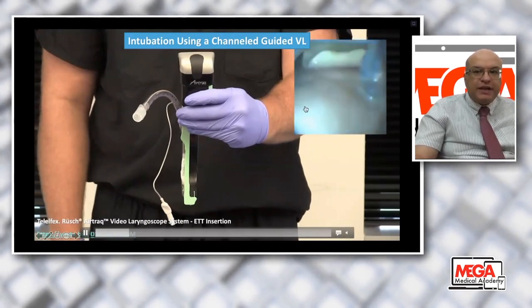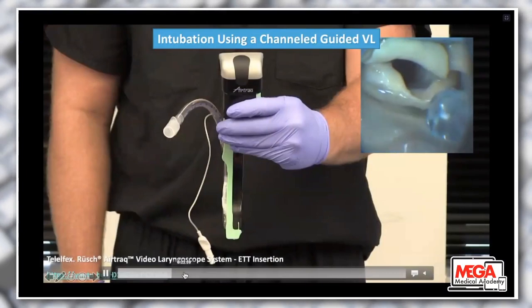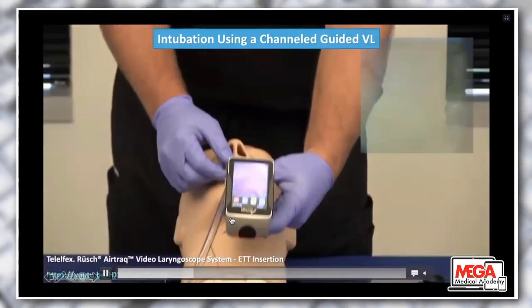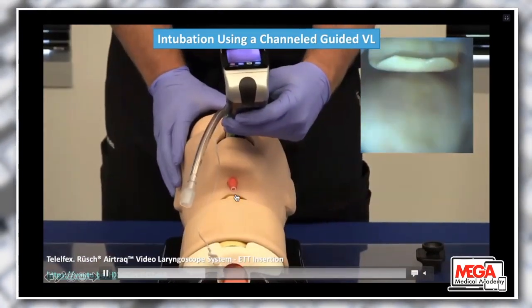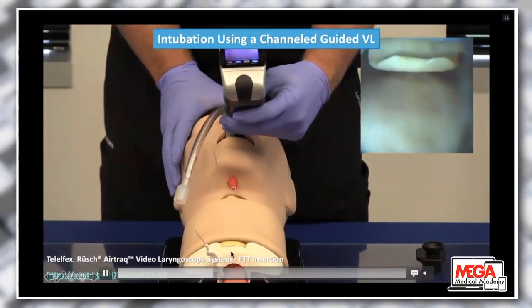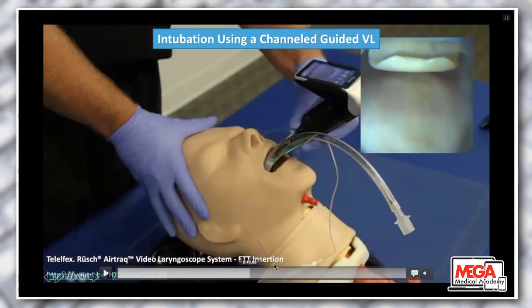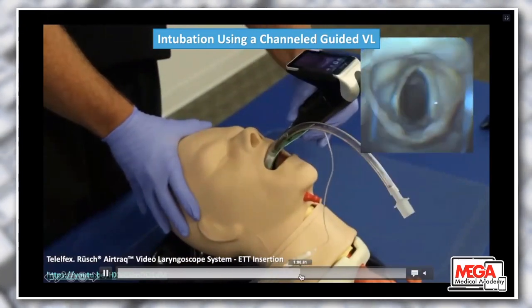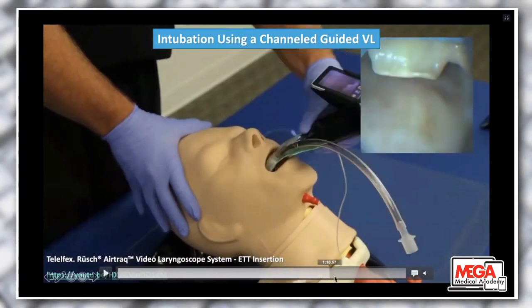Do suctioning for the glottis to avoid obscuring your view with secretions. Now insert the scope through the mouth with the display facing the feet of the patient. As you can see, then advance it in, moving it backward towards you with some twisting movement to adjust the view.